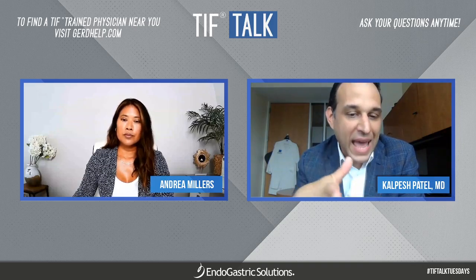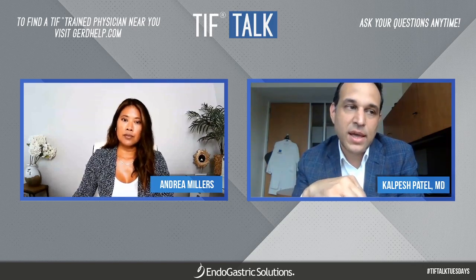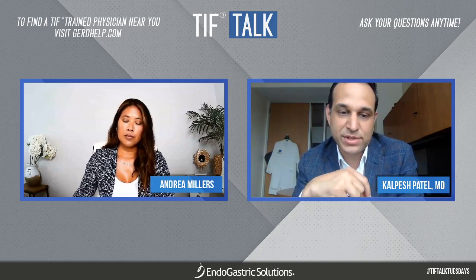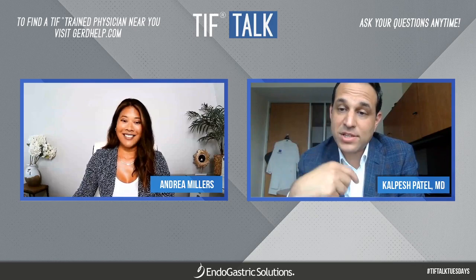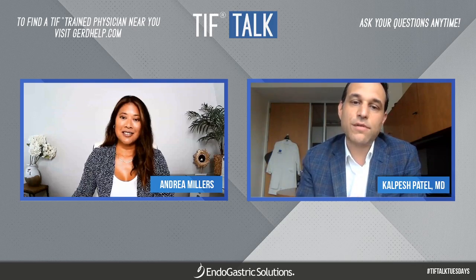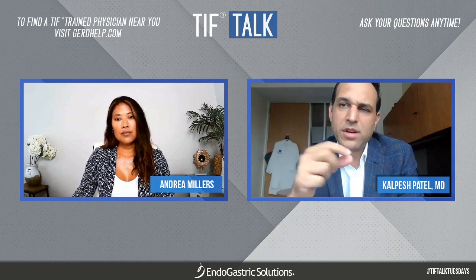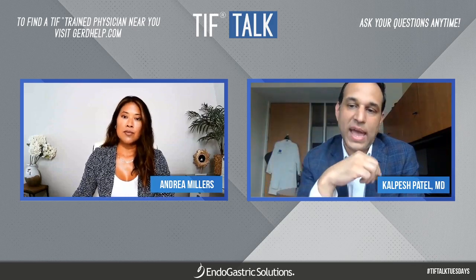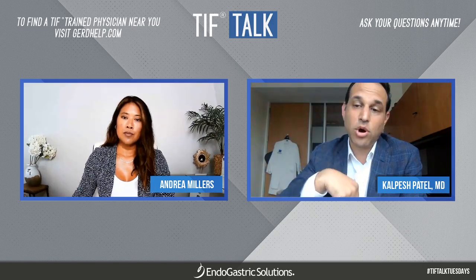Oftentimes I'm seeing patients who've already had that part done and are still struggling with what's the next step in my reflux. And there we often will consider what's called pH or acid testing procedures. And this is very, very cool, if you ask me. It's a way for us to actually record the frequency and severity of your reflux using an instrument, a probe. There's a variety of kinds. Some are placed internally, some are attached to a very thin nasal catheter, and they actually sit in the middle of the esophagus, very, very small.